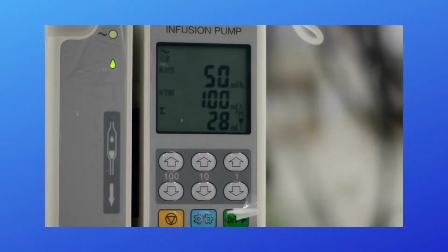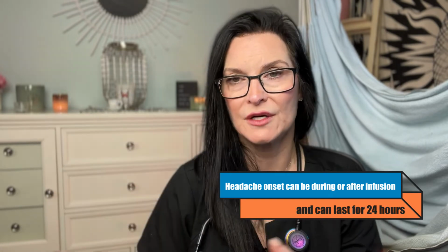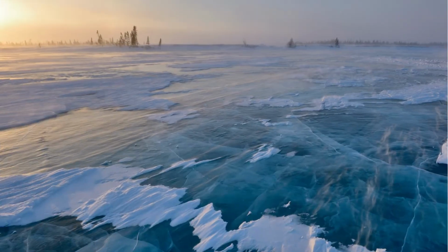And then there is what's called an infusion rate sheet sent over by the pharmacy. And if you are truly asymptomatic, meaning you're not having any outward side effects that she can see or that you're saying, she will then increase or ramp up your infusion rate to go a little bit faster, and then she'll watch you again. You know, it's increase rate, watch, increase rate, watch. And ultimately, the goal here is to get to a rate that's higher and will finish your infusion before the next ice age comes, but also keeps you comfortable.